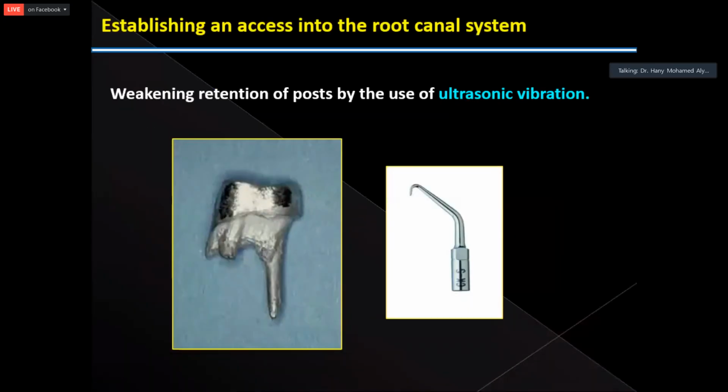Another way of removing a post, such as a custom-made post, is using ultrasonic vibration, using the ultrasonic tips.